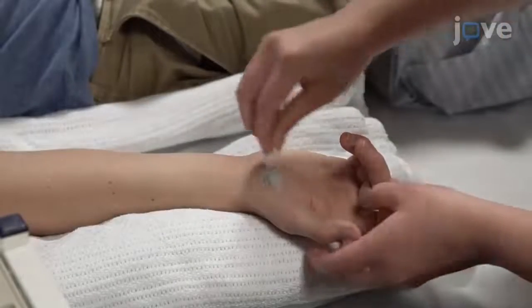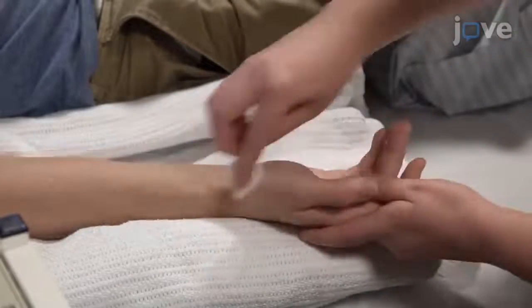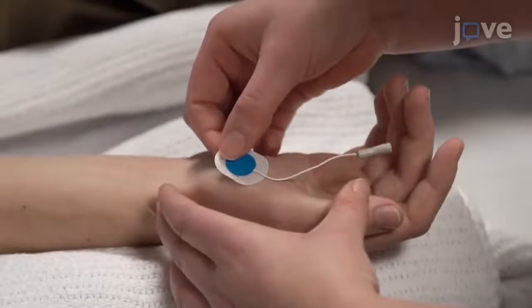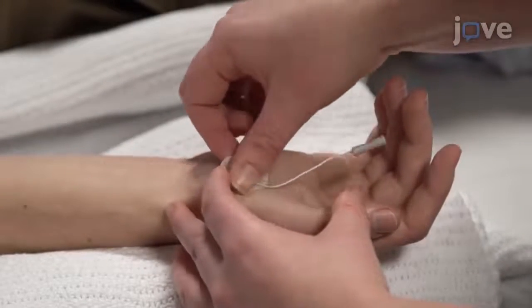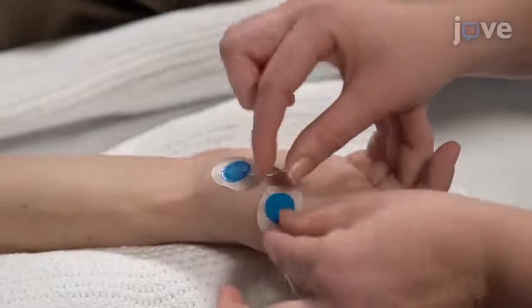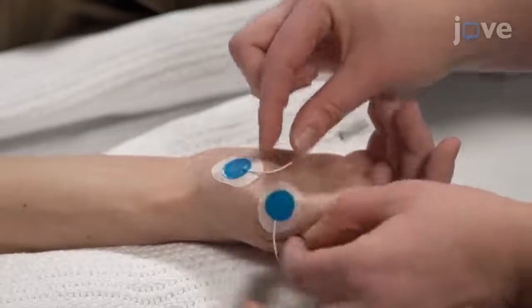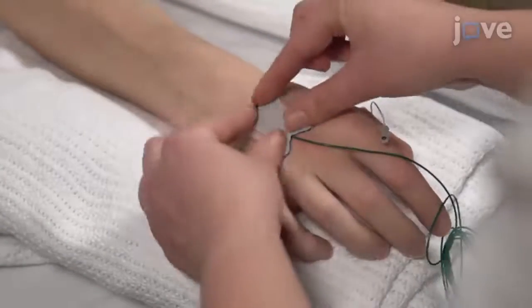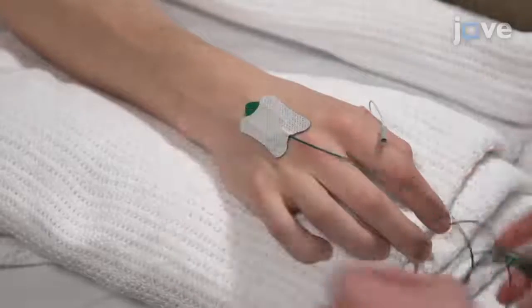First, use skin prep gel and alcohol to clean the subject's hand and forearm. Position the active recording electrode over the abductor pollicis brevis muscle, then place the reference electrode on the metacarpophalangeal joint of the thumb. Place a ground electrode on the dorsum of the subject's hand and connect the electrodes to the pre-amplifier.